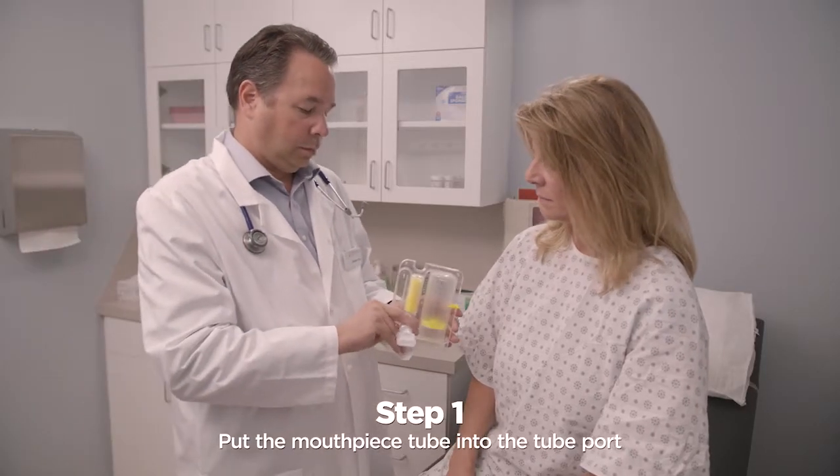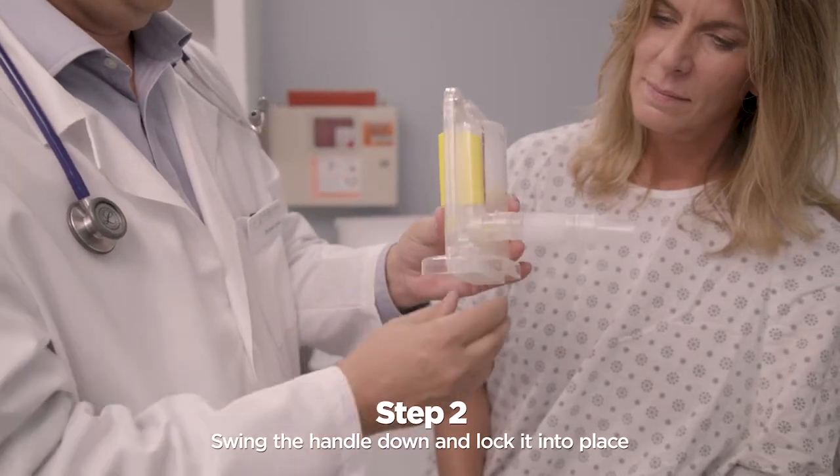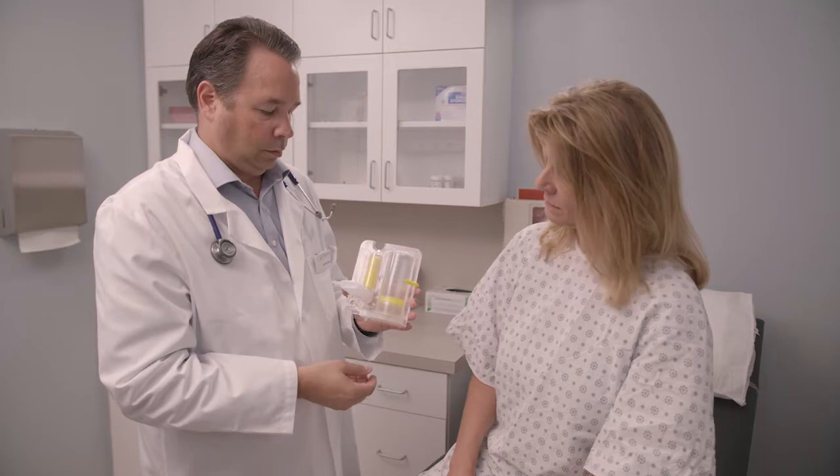Put the IPEP mouthpiece tube into the tube port. To use the handle, swing the handle down. Push the handle up to gently lock into place. Fold the handle back into place when not being used.